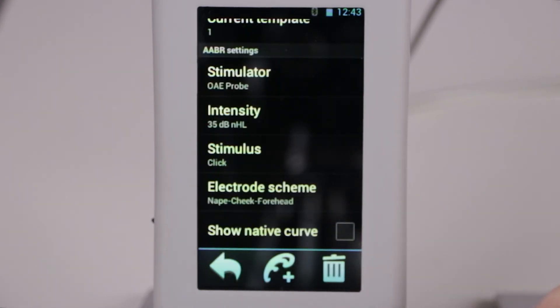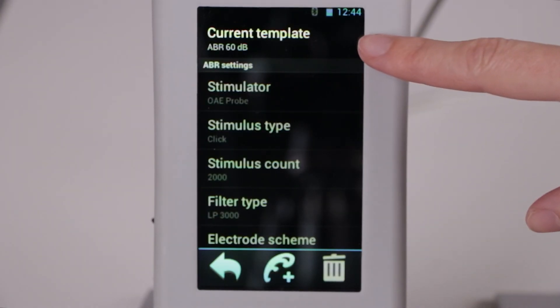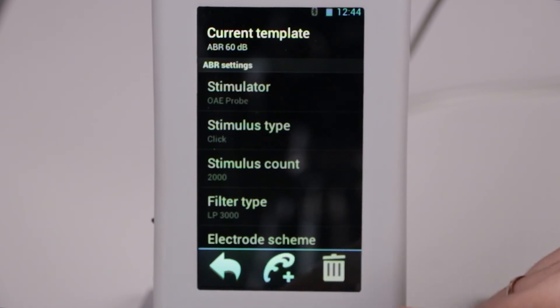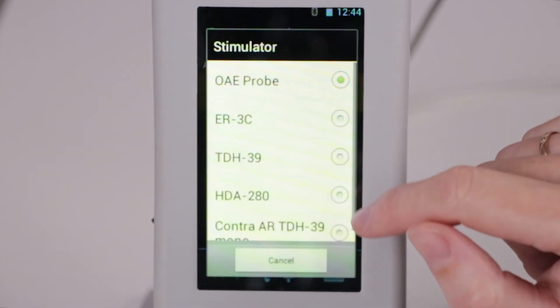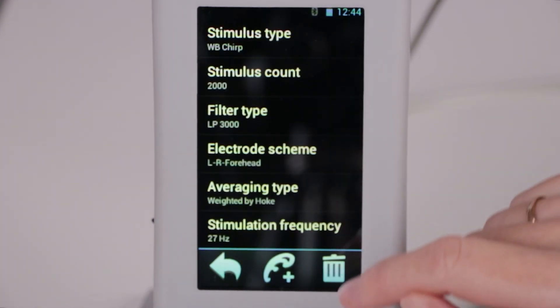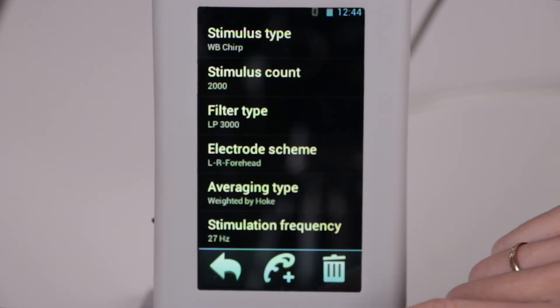This is especially relevant for small babies. You can also click here if you want to watch the native curves to estimate the quality of signal during acquisition. In the ABR settings we have one default template and you can see all the parameters. If you want to change something, create a new one. In a custom template you can change the type of stimulator, stimulus type, stimulus count, and so on. You can also choose different types of averaging and stimulation frequency. After you've finished the setup, go to the main menu.